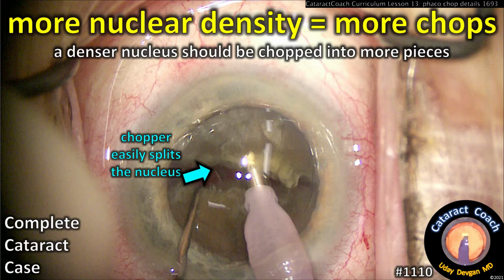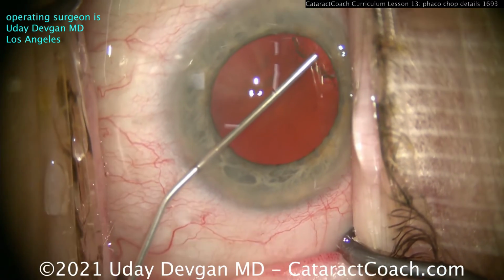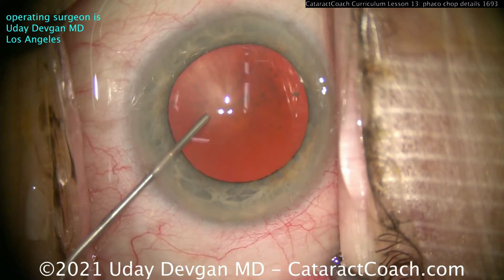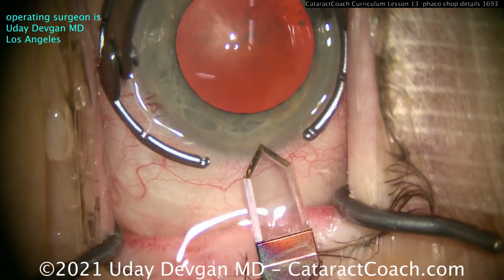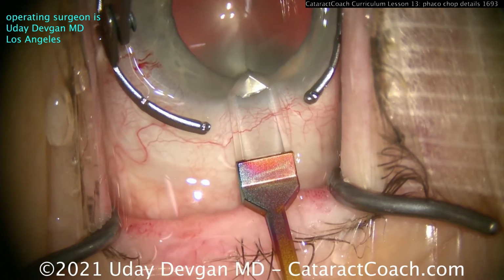More nuclear density means more chops. A denser nucleus should be chopped into more small pieces. Let me show you this. Now, it doesn't look like too much nuclear density because the red reflex is so good. Remember, we adjust the microscope lighting to achieve that, plus I alter it here in post-production to really give you a better view. We'll make our main temporal incision here with a diamond keratome.